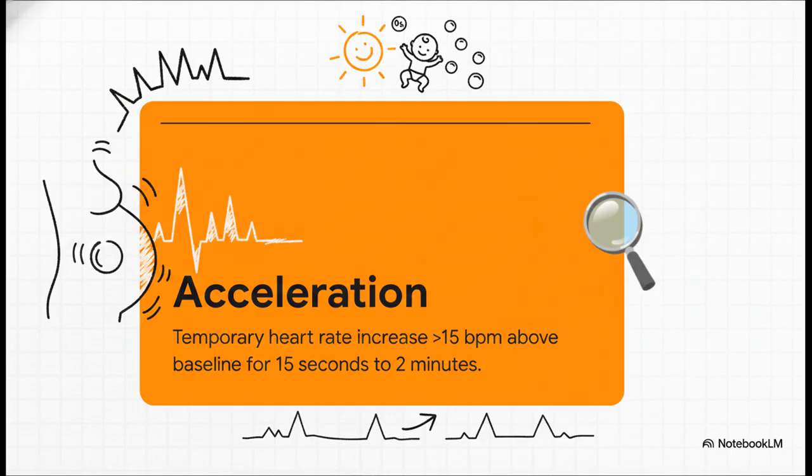But what does that actually mean in plain English? Basically, it just means the baby is moving around or reacting really well to the contractions. You absolutely do not need any medical interventions here. Seeing this proves the baby is healthy, responding normally, and getting plenty of oxygen. It's exactly what we want to see.